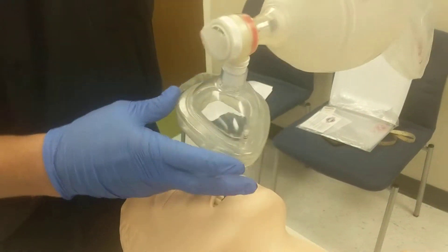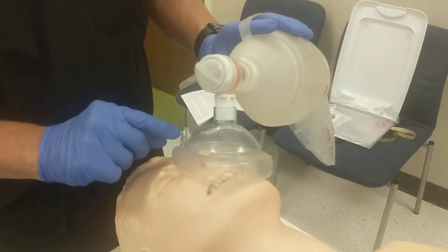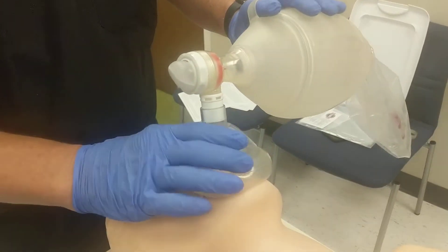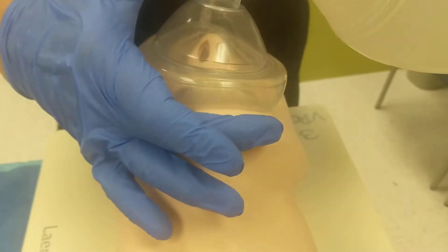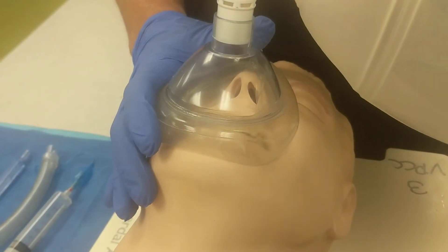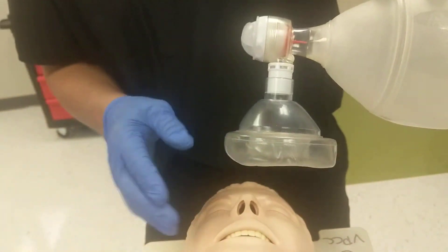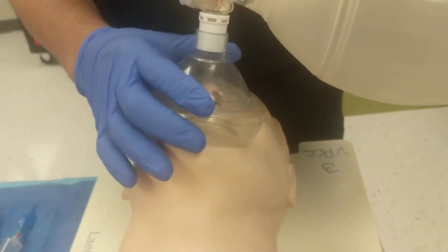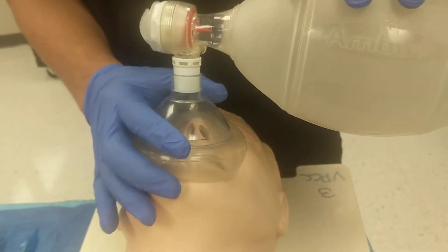The mask is teardrop shaped. Make sure the apex or point of the teardrop is right over the bridge of the nose between the eyes, and the bottom aspect of the mask should go right on the chin — not below the chin — otherwise you won't be able to seal the mask. There is an air-filled balloon that surrounds the mask; it is compressible and allows us to seal the mask around the patient's face.